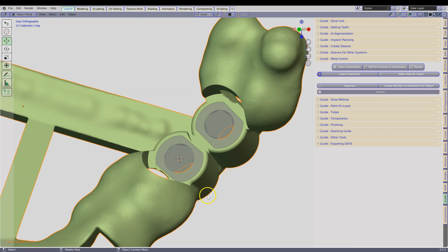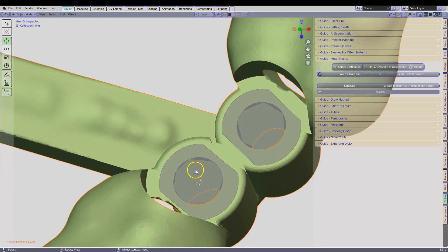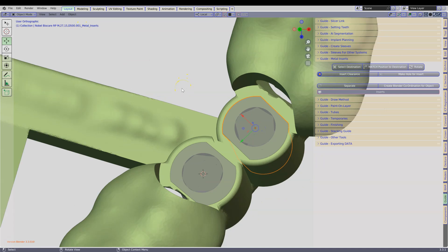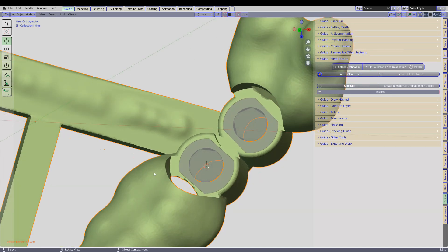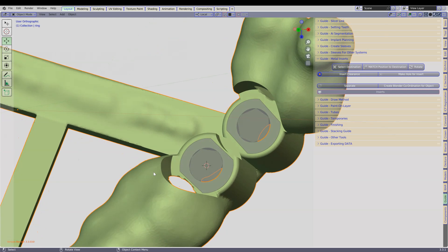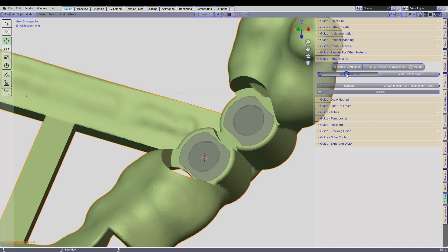Finally we would like to cut the guide. Notice that these inserts now have the order numbers included, which makes ordering way more simpler. Make sure that you select the object. This object is called Ring. Now click on Insert Clearance.